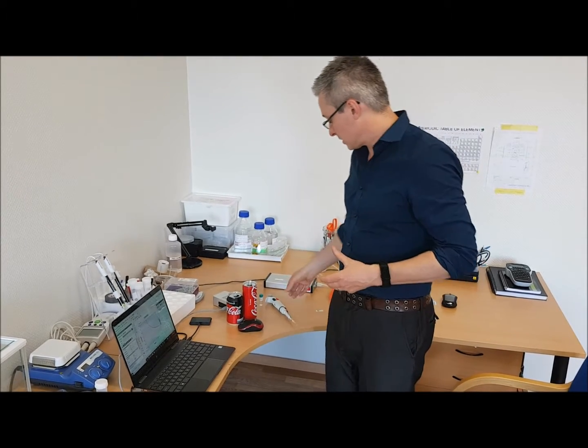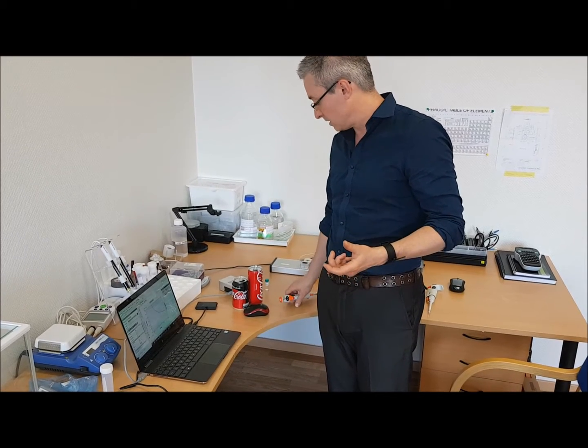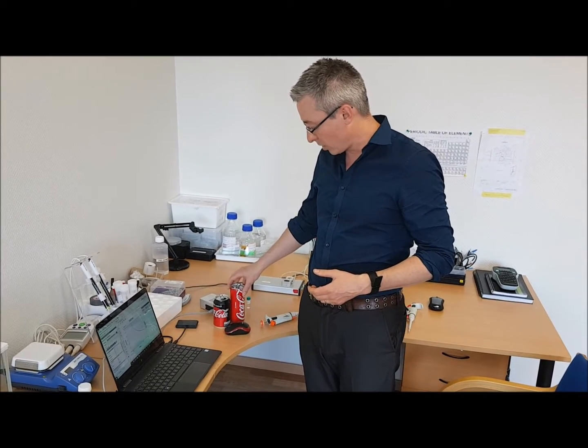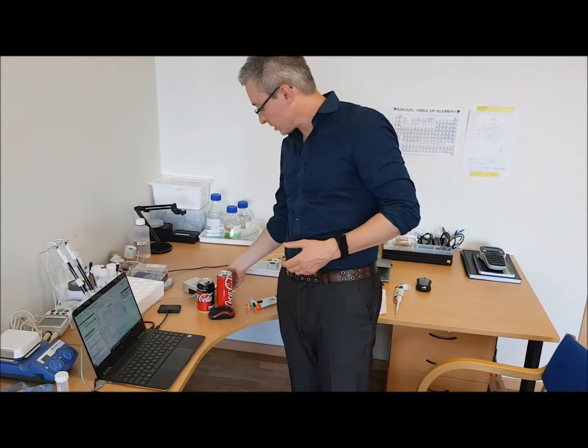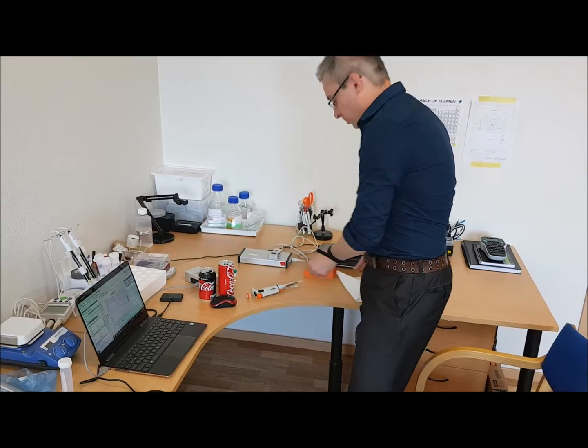What I'm going to do first is demonstrate how easy it is to use a glucose sensor to measure the glucose in regular Coke versus Coke Zero, which has no sugar in it. So let me show you one of these glucose sensors.